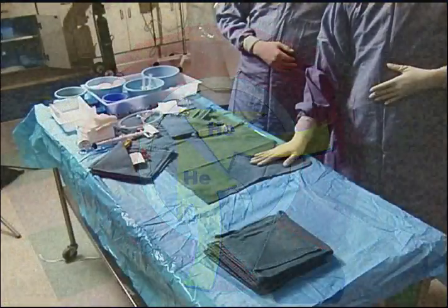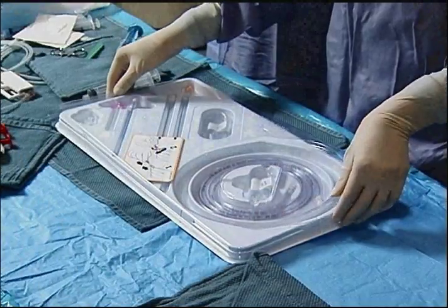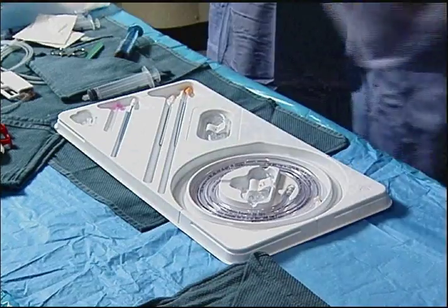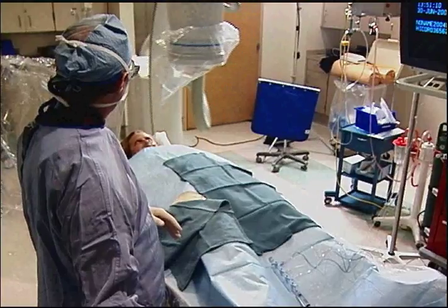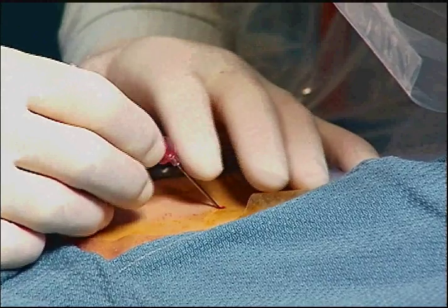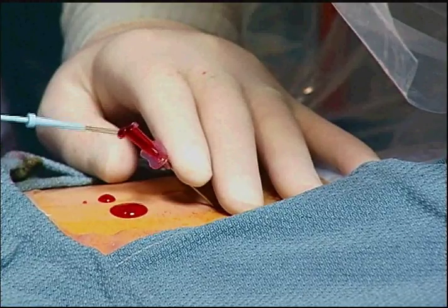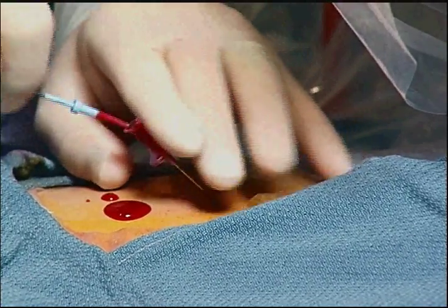To prepare for sheathless insertion of the intra-aortic balloon catheter, open the sterile insertion kit first. It contains all remaining required equipment for balloon insertion. Prep and drape the patient in the standard fashion for cannulation of the femoral artery. Insert the 18-gauge angiographic needle into the femoral artery. Use a shallow angle of entry to minimize the potential to kink the catheter.